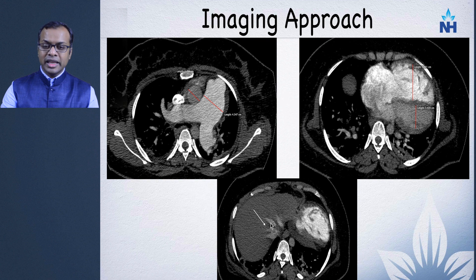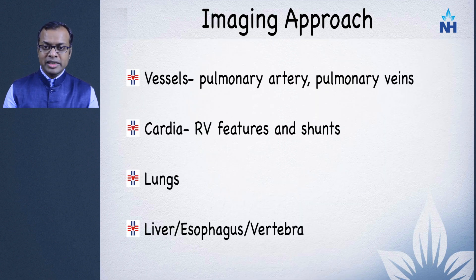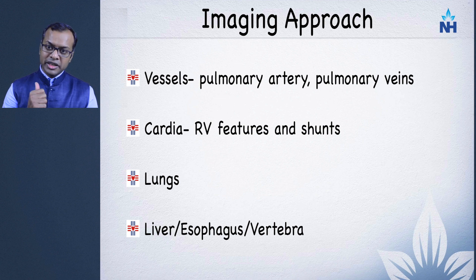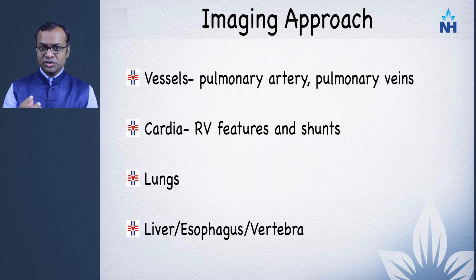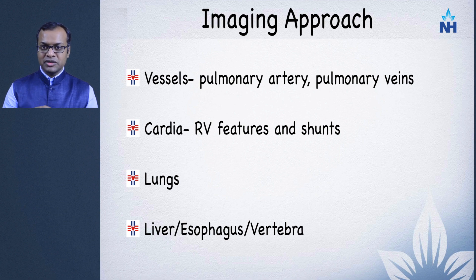Once those features are noted, begin a stepwise approach. First, look at the pulmonary arteries for acute or chronic thromboembolic disease. Second, look for abnormal communications between the pulmonary arterial and venous chain — any fistulas. Then examine the pulmonary veins to ensure they all drain normally into the left atrium and that there is no partial or total anomalous pulmonary venous connection.